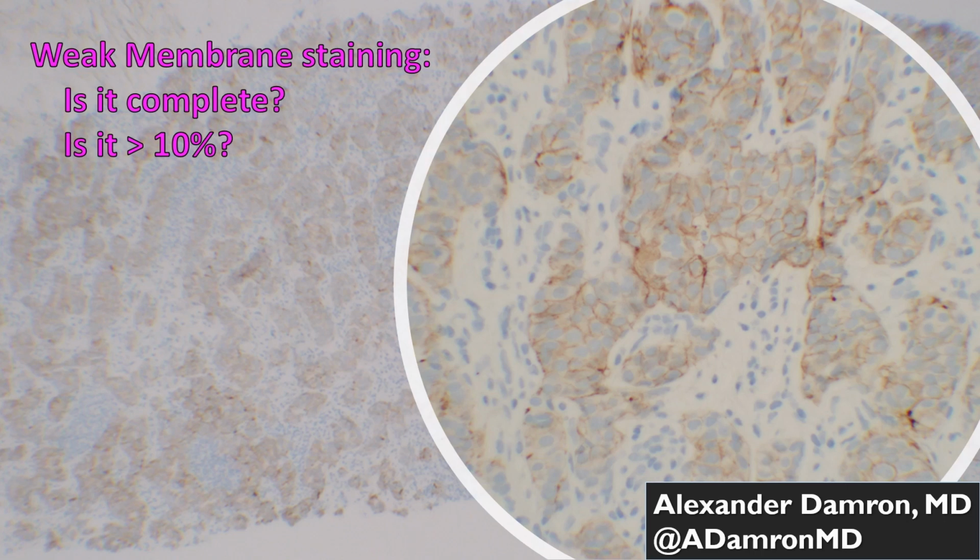So do you try to combine those to come up with is it greater than 10%? Because the vast majority of the excision in the breast was 2+, and in the lymph node there's some 2+. So I give them the benefit of the doubt in that scenario because I'm thinking about the patient as a whole. The patient clearly has some equivocal staining, and in this case I decided to test both, which were negative by in situ hybridization.